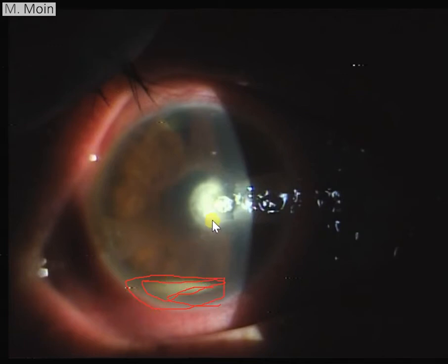The second thing which you're seeing is this corneal ulcer. So the corneal ulcer has got two parts to it. If you look at this, this is the area which is more dense and this is the area which is less dense. So this is where the activity is going on in this patient. And the other thing which you see is this discontinuation of this opacity over here, but the active ulcer is over here. And then there you see a faint opacity over here as well.